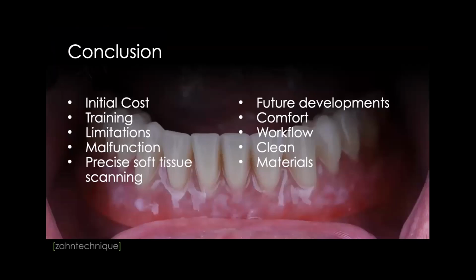When you're going digital, you have to keep in mind that the initial cost of the equipment is going to be a good sum. You also have to be properly trained and remember to train your staff. There are still some limitations with digital dentistry today. And then also technology: how many times have you had a malfunctioning computer or a printer? The same thing can happen with your digital equipment. So not leaving things to the last minute and always making sure that you're servicing your equipment properly is very crucial.